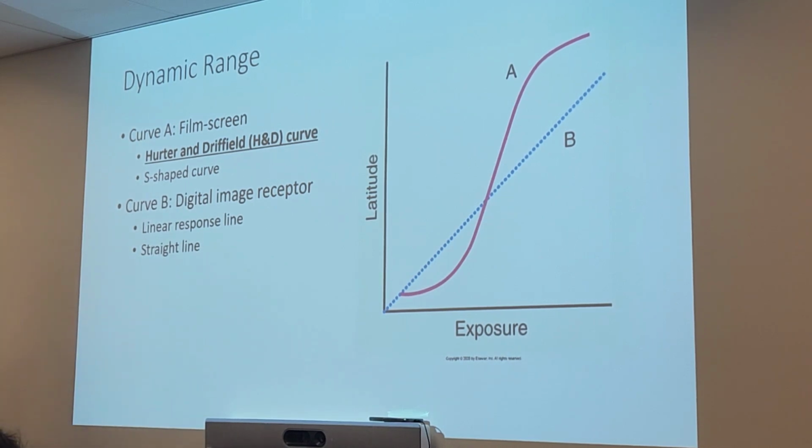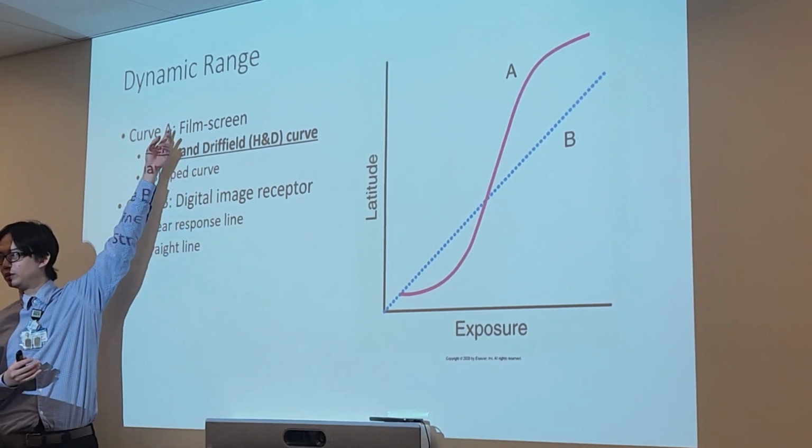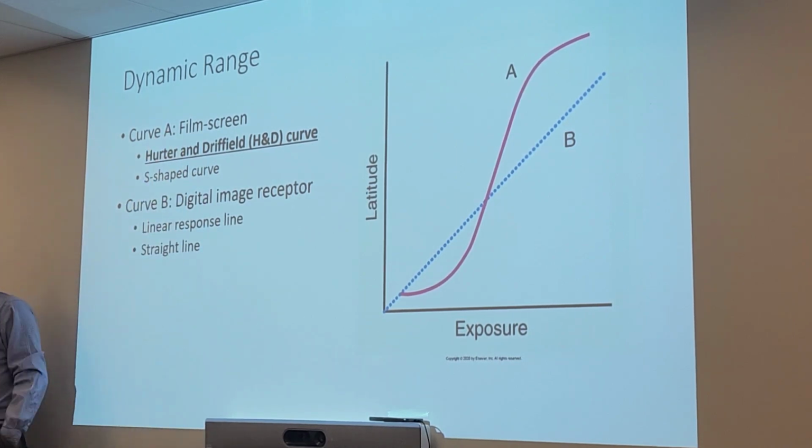If it wasn't, right, it would either look too white or too dark, and there was no such thing as windowing or leveling because it was on film, right? It was a physical piece of film. You couldn't change it. So that was the good old days.